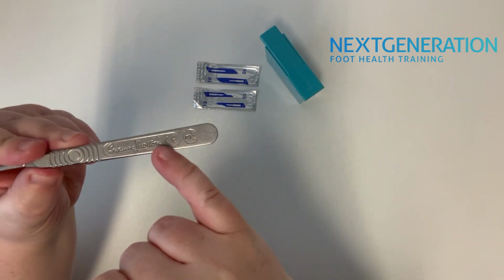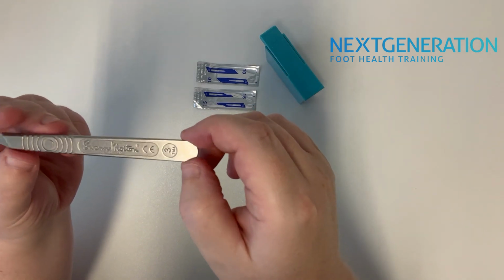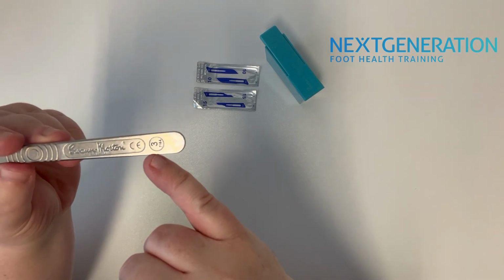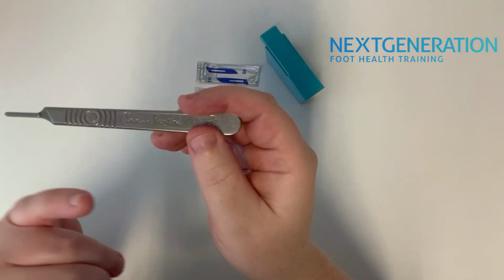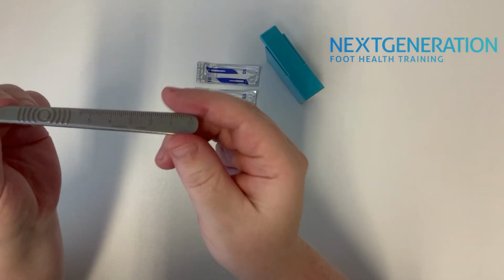So you can see it's got the make on the top, actually a Sheffield company, so very local to where we are in Huddersfield. And it's got the number there, number 3. Whilst we've got it this side up, and it's really important to know which side up you've got it, on the other side you've also got a measurement.